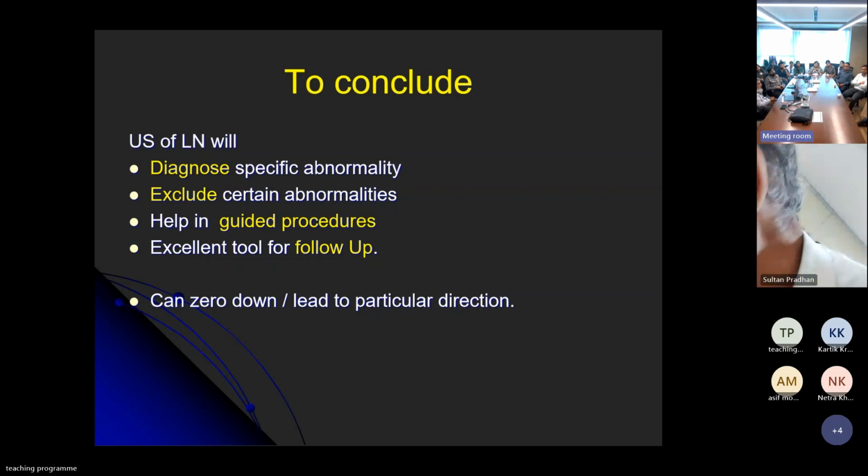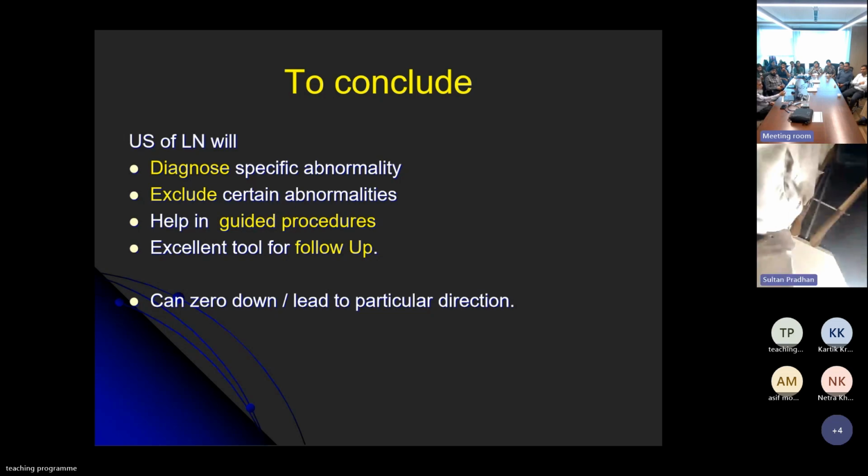So I think we are seeing 2 to 3 millimeter inclusions. In certain cases, the node looks absolutely flat, and I'm sure it would not be a palpable node, and that inclusion just stands out because of the difference in echogenicity. That is the most important point, that we picked up more nodes. These are not published studies, but whenever we used to get dissections done by you people, we would see which node looked abnormal. Sometimes dissections do not mention each level separately, but when it is mentioned, we tend to understand that we picked up the correct node.